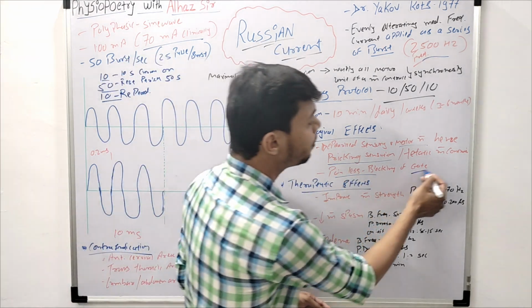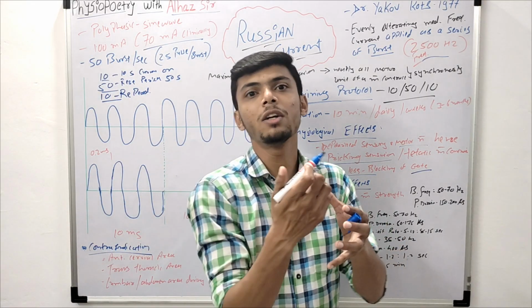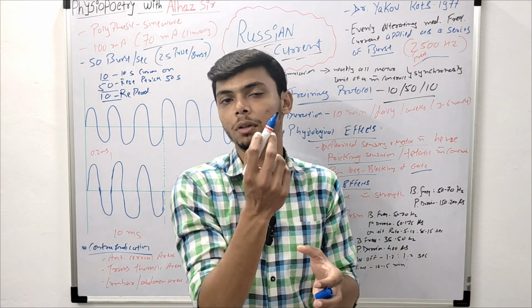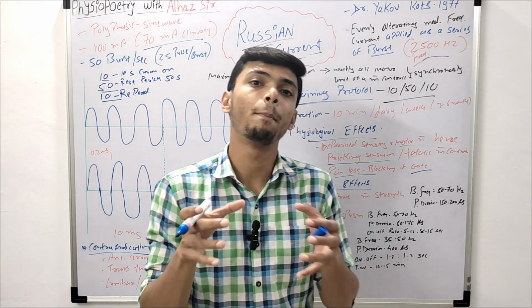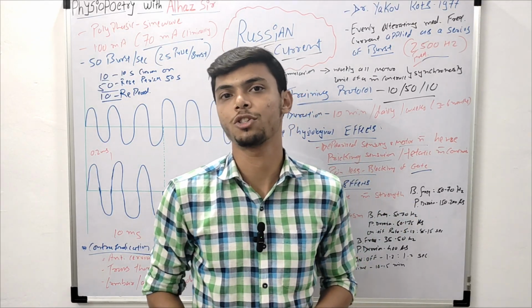So the gate will be closed. The substances related to nociception, the gate will be closed because sensory nerve fibers are coming up towards the brain and they are blocking this pricking sensation. They will block the pain sensation.